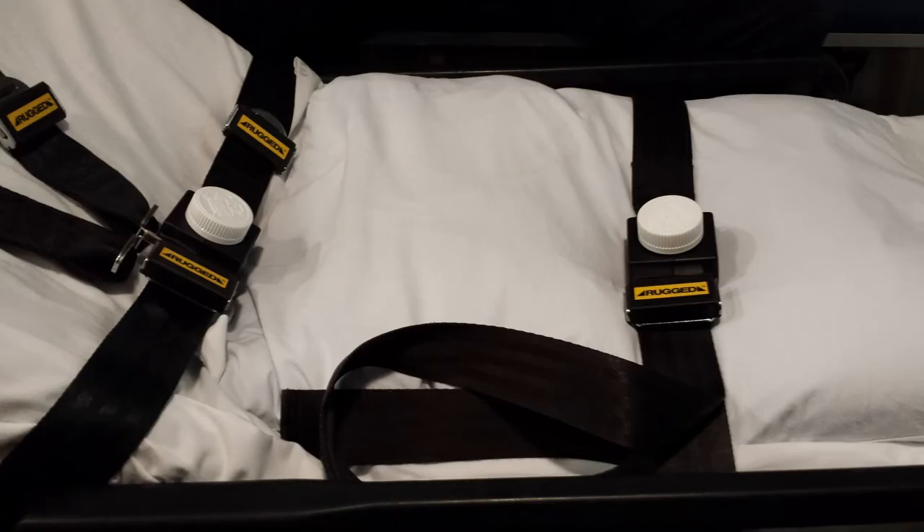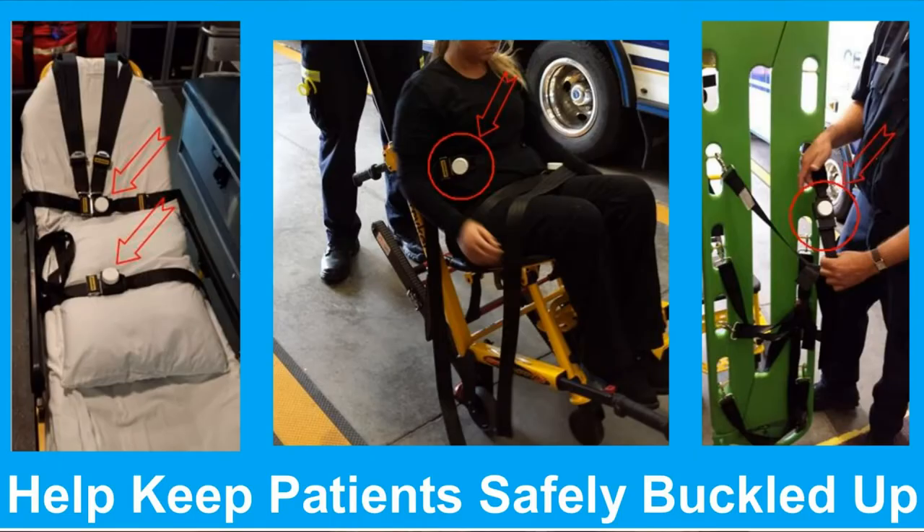So help keep you and your team safer by keeping your patients safely buckled in. Buckle guards fit on most of the equipment you use. They're effective, affordable, reusable, and they're invented and made right here in Minnesota.